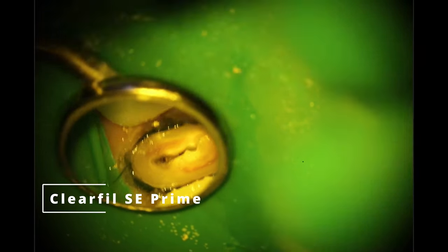Going to start the bonding process. We use ClearFil — I currently use the three-bottle system, but I'm going to switch to the two-bottle system after talking with a couple of endodontists; it seems to work just as well and saves you that extra step. Should be a little bit better. I just ordered that from eBay, and we'll be getting that in just a bit. Drying off the primer, coming in with the bond now.